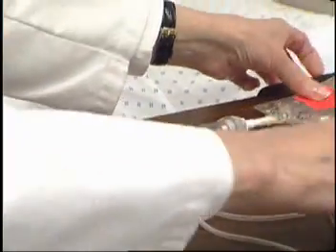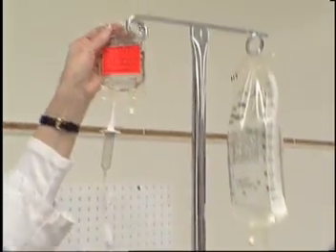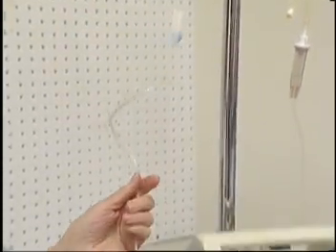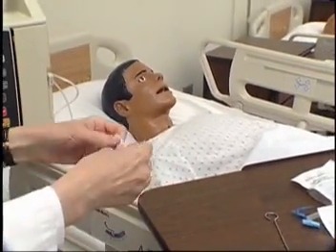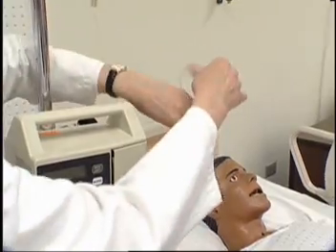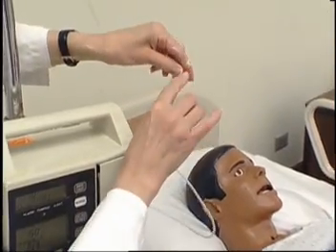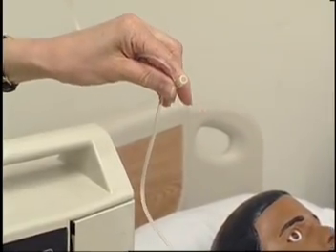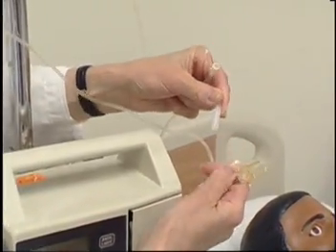Hang the secondary bag on the IV pole. Cleanse the injection port of the primary tubing above the electronic infusion device with an antimicrobial swab. Insert the needleless cannula of the secondary piggyback tubing into the primary port.